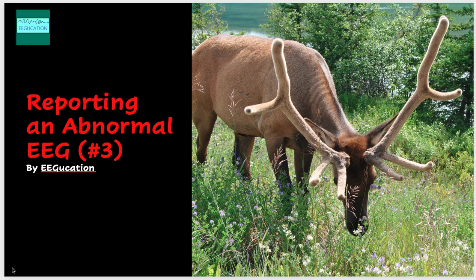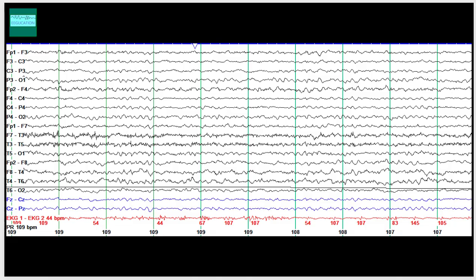Good morning. We'll start with our case today. This is a 25-year-old man with a previous history of meningoencephalitis who now presents with spacing out episodes in the clinic. The patient was referred for an EEG to identify if there were any epileptiform discharges. Let's get started from the first page.